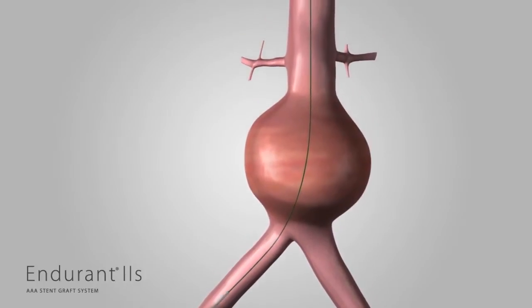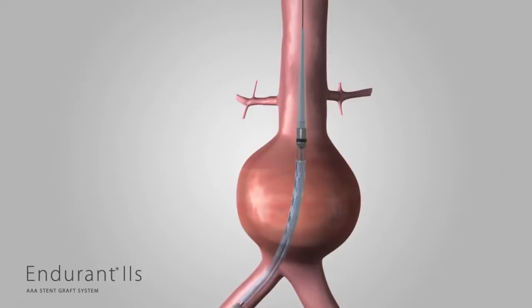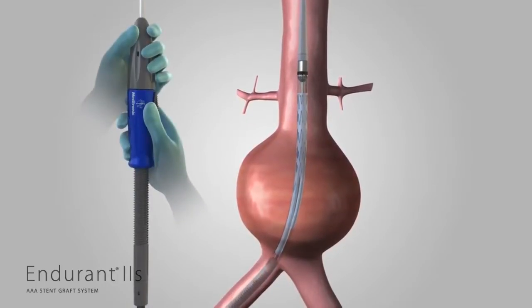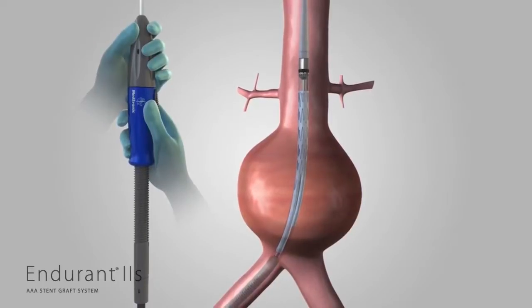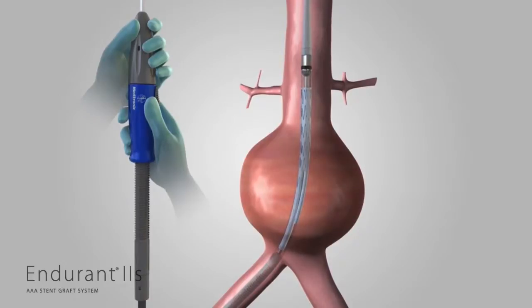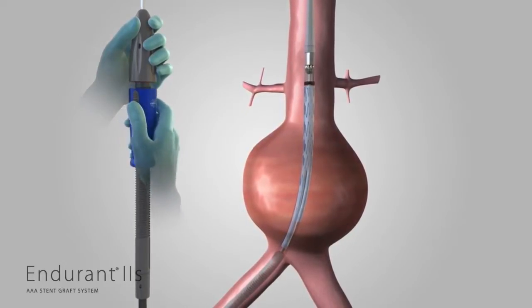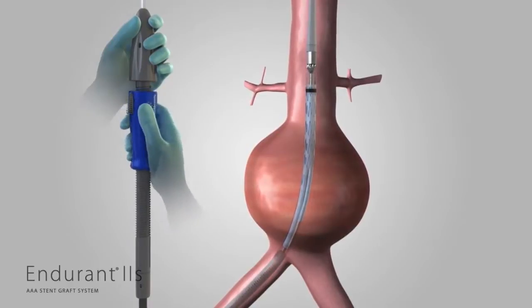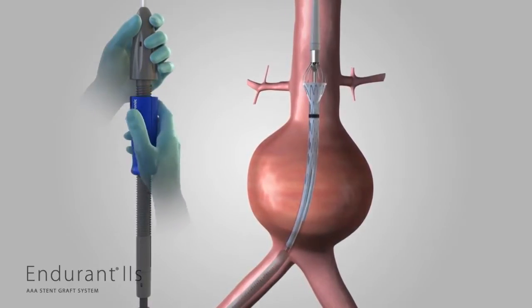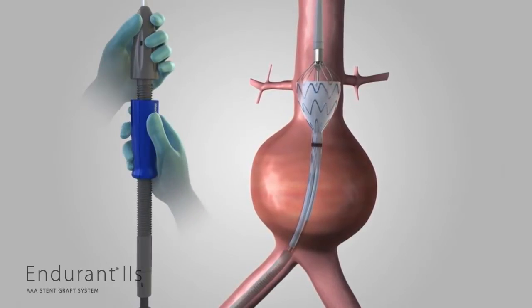Slowly insert the delivery system until the proximal stent and the radiopaque markers are visualized in the aortic neck. With one hand on the front grip, hold the aortic delivery system stationary. Next, slowly withdraw the graft cover with the other hand by rotating the slider counterclockwise in the direction of the arrows until 2 or 3 of the covered stents have been deployed. Use angiography to verify the position of the stent graft in relation to the renal arteries.